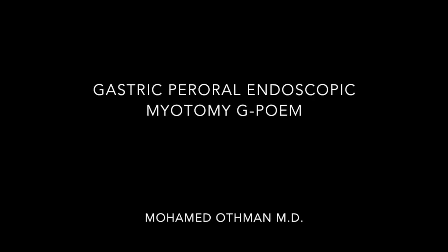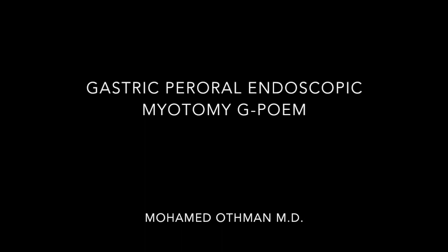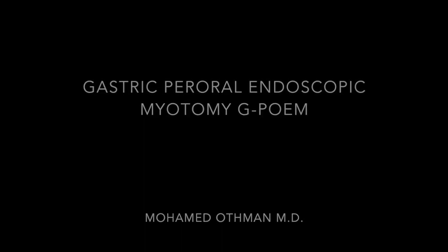Hi, this is Mohamed Othman. In this video, we'll discuss gastric peroral endoscopic myotomy, or G-POEM. This is a procedure to perform pyloromyotomy in patients with gastroparesis. Our patient here has post-vagotomy gastroparesis, which is a perfect indication for this type of procedure.